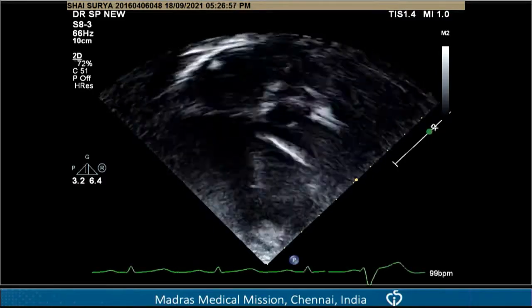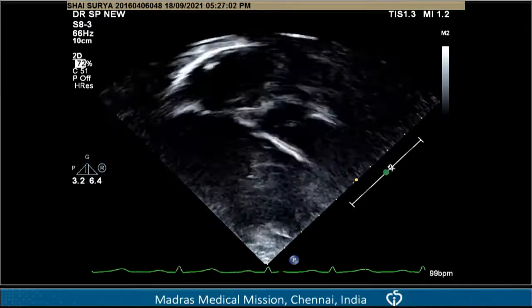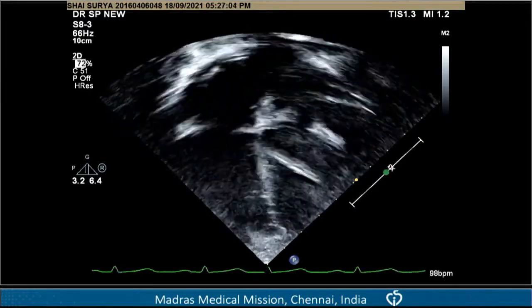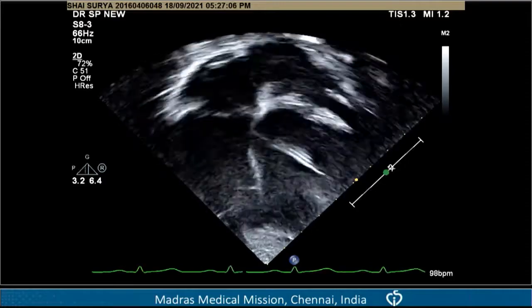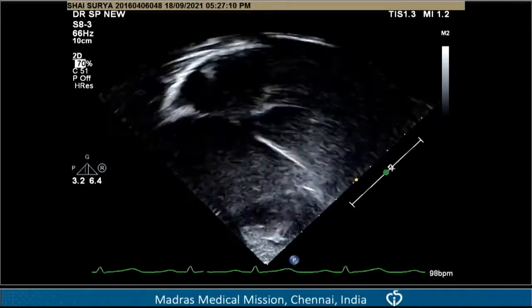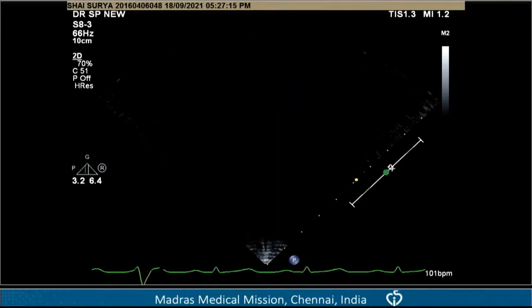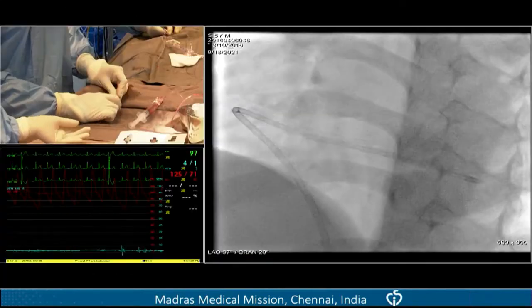Okay. Keep fixed on the picture. Now see the... I'll try to do it without fluoro. Pramod, once can I go to the tip of the sheath and then you give me the same picture? So show us your hands and fluoro in the meantime.